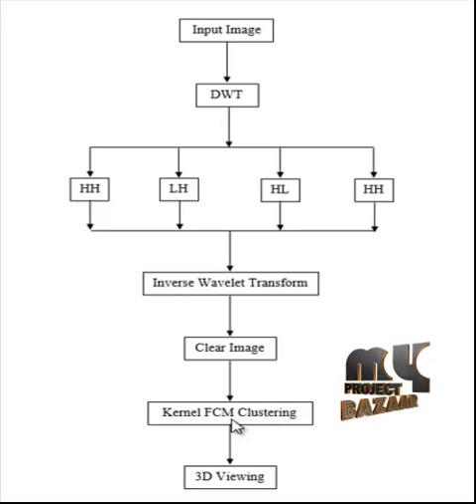This process is helpful in the 3D viewing of input images, which is employed based on kernel based fuzzy C-means methodologies. For that, the input images are initially enhanced based on the wavelet transformations applied using discrete wavelet transform. The 3D viewing of the images will be more helpful in further research on the analysis and the registration of medical shapes.